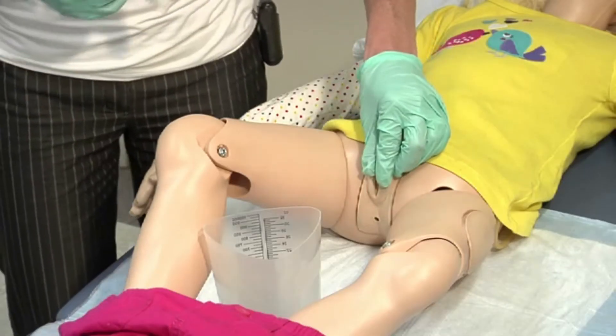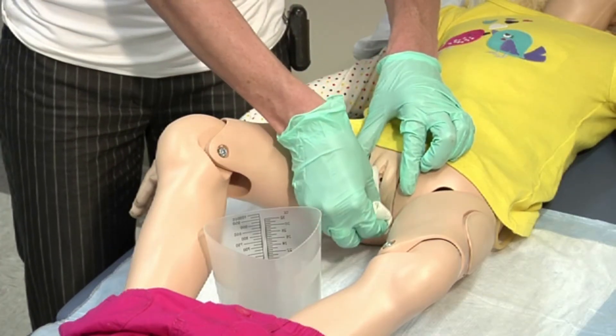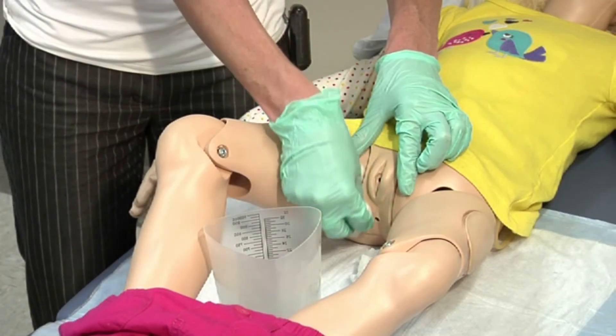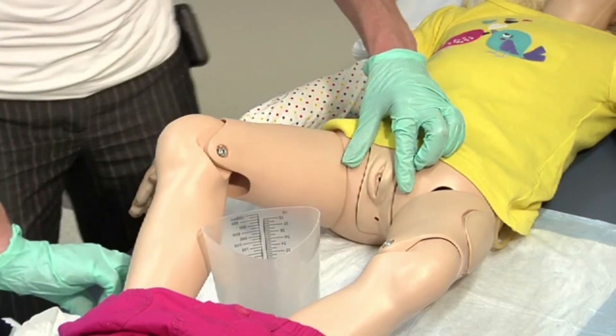With your non-dominant hand, separate the labia and hold open with your fingers. Using your dominant hand, wash the area with cleansing wipes or washcloths, starting at the top of the labia and moving toward the anus. Repeat the procedure a total of three times — once down each side and once down the middle — using a clean wipe or washcloth each time.